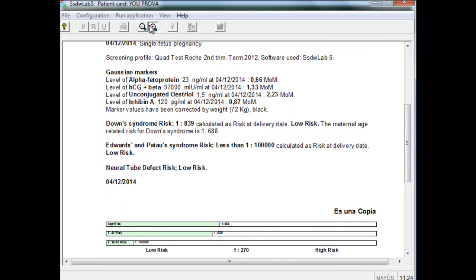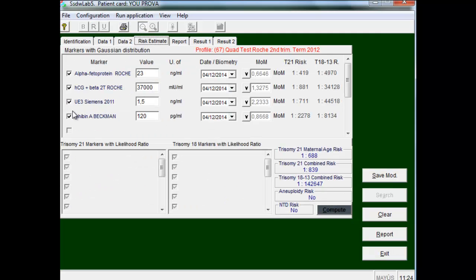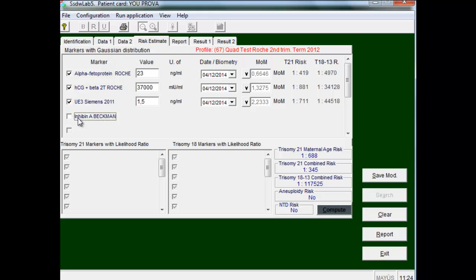Suppose we wanted to do a triple test. Then we just cancel the inhibin A and we obtain the result of a triple test.